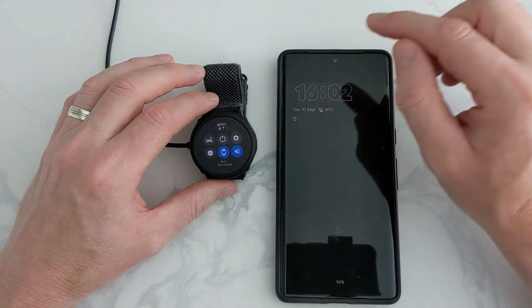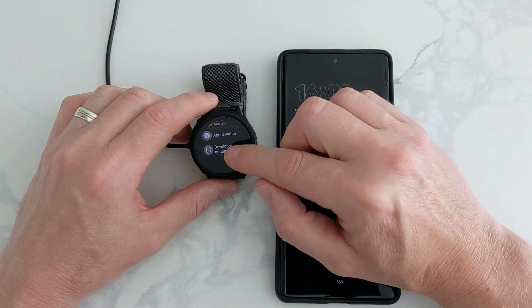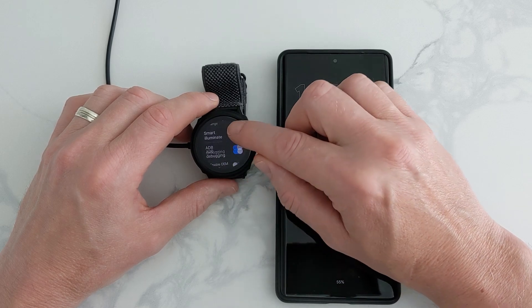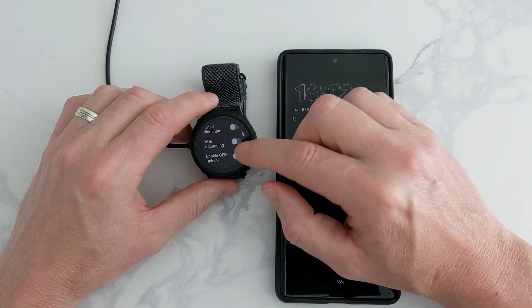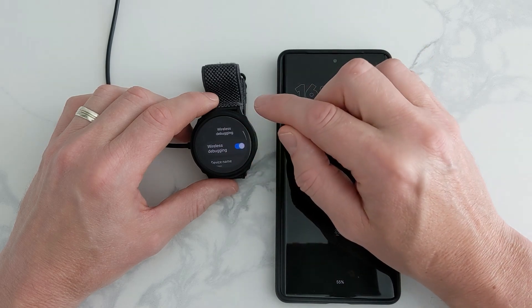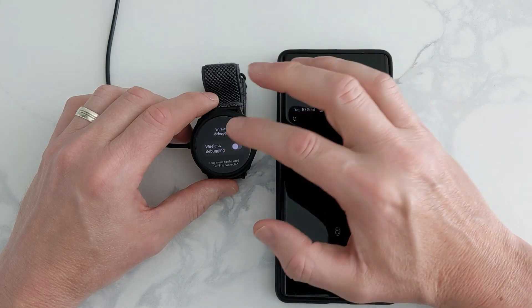Once done with the installation, best policy is to turn off ADB Debugging — back in your options, turn it off there. And also turn off Wireless Debugging as well. It just saves your battery.